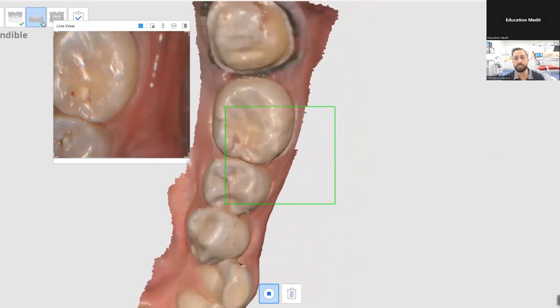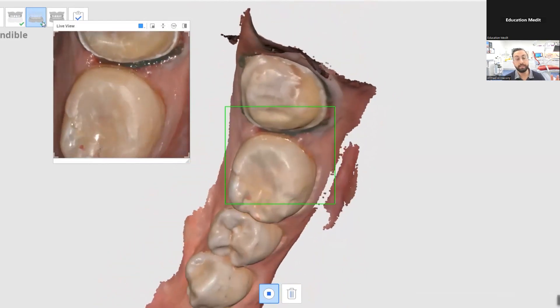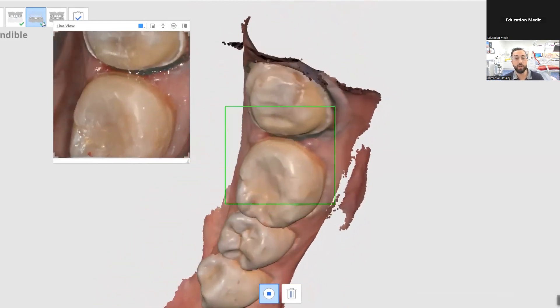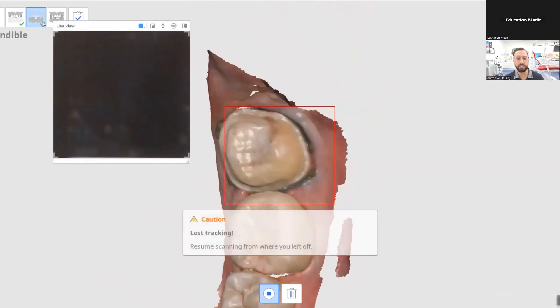A common thing with scanning these cases is to make sure you're scanning the interproximal well, and this can be difficult — especially if you have very tilted molars or large embrasure spaces. This can be very tricky and you may miss this area.